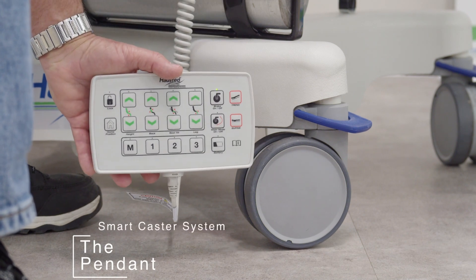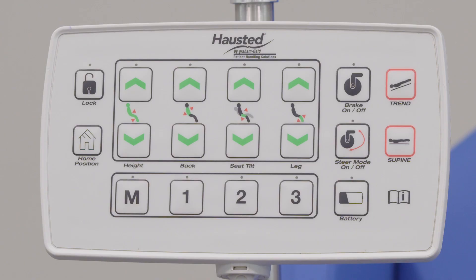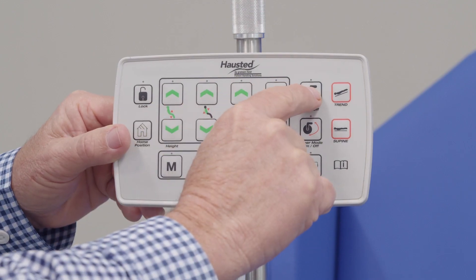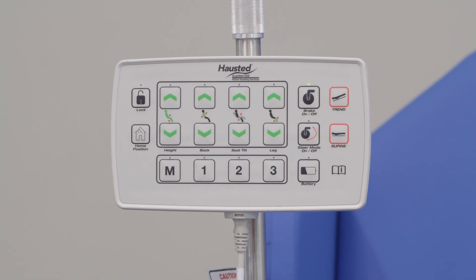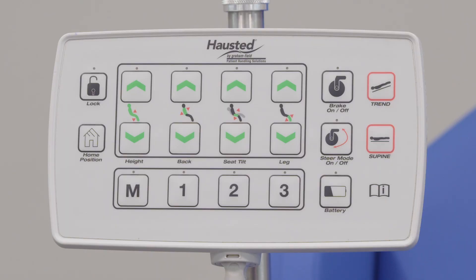Let's start by taking a look at the pendant. If left unattended, the pendant goes to sleep. You will need to wake up the pendant. When the unit sits dormant for 30 to 45 seconds, there will be no LED light, meaning the unit is not ready to perform any functions.